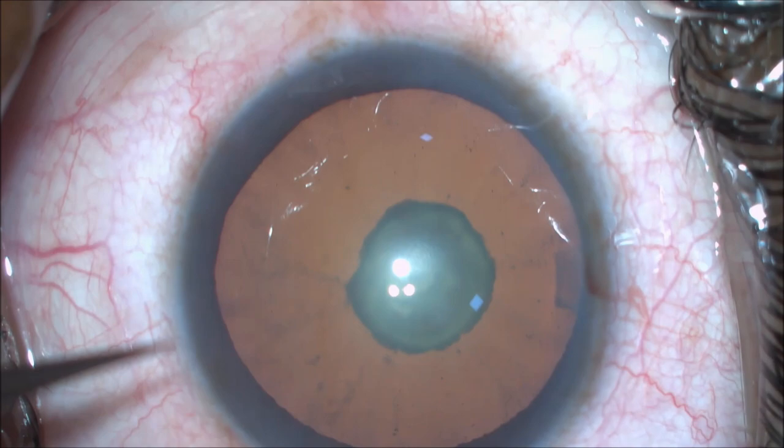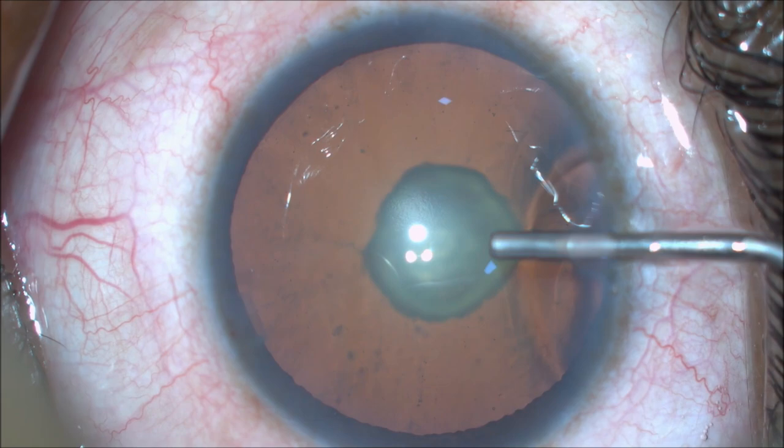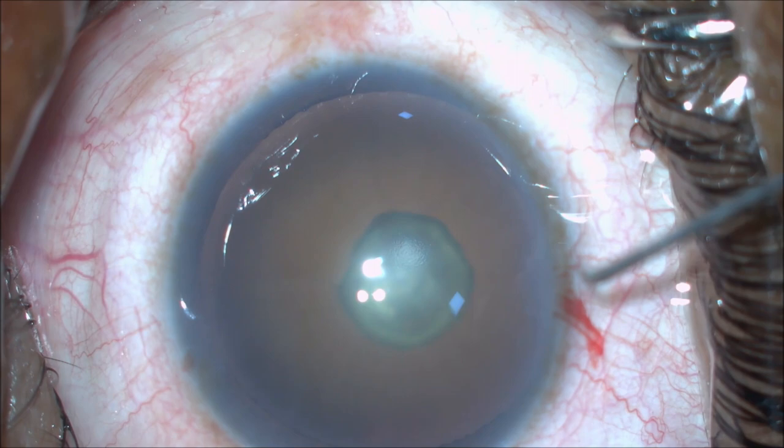After making two side port entries, REXIS is initiated. Good capsular REXIS is the important key point in any cataract surgery, especially in challenging cases.